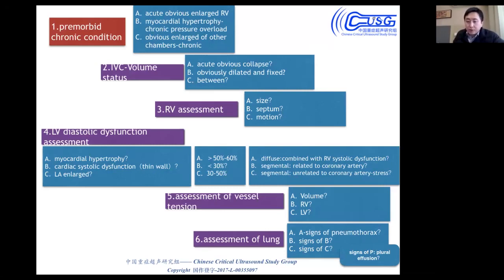And we should assess the flow of the kidney as a marker of how the other organs are perfused, and if another stage of optimization should be studied.